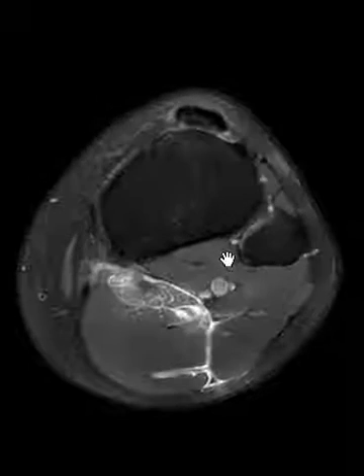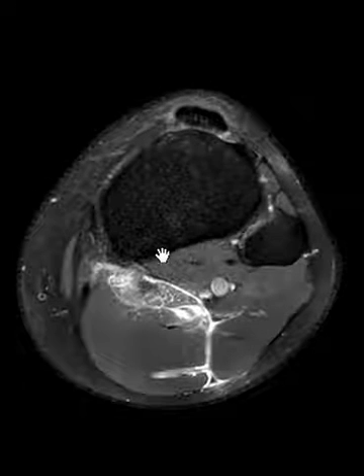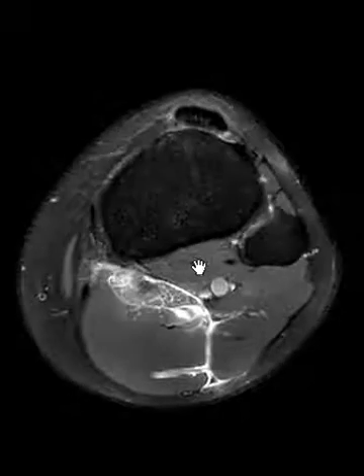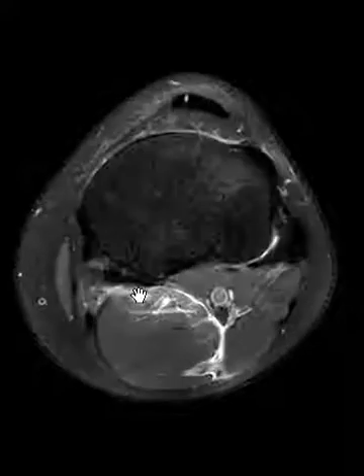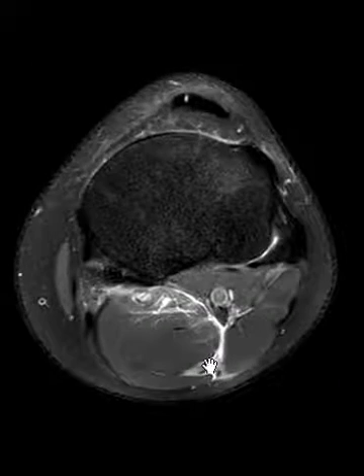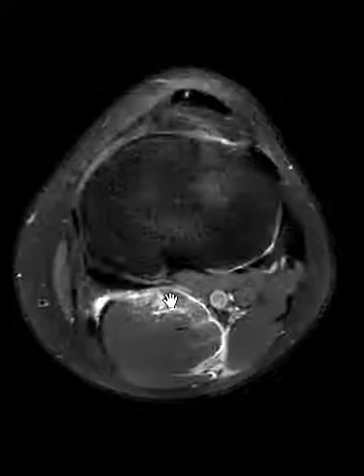The popliteus muscle belly here looks pristine. We see something wrong in between here, between the medial gastrocnemius muscle and the popliteus muscle. We see another area of abnormal signal — looks like a whole other muscle that's got hemorrhage within it, edema, and some leaking fluid or hemorrhage.